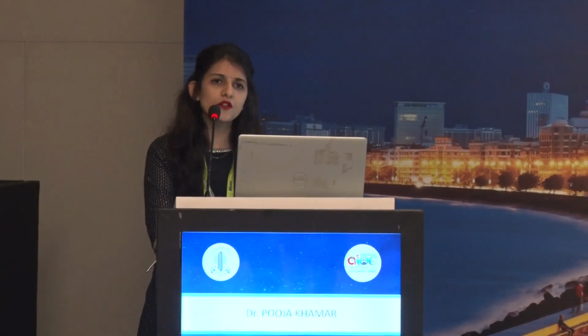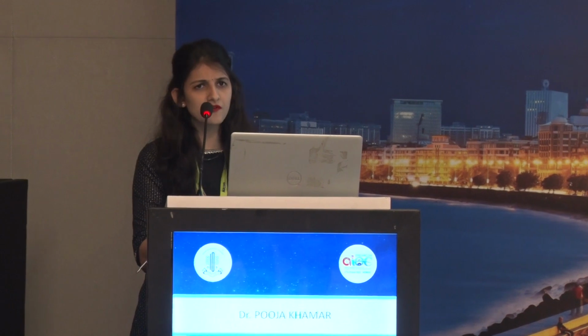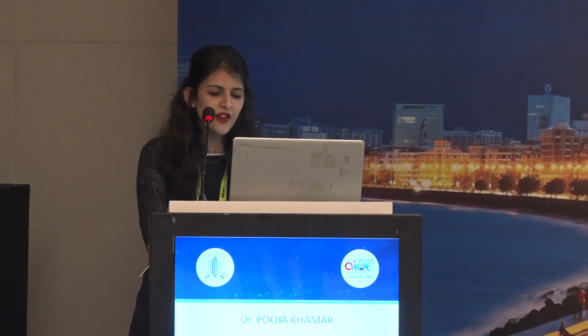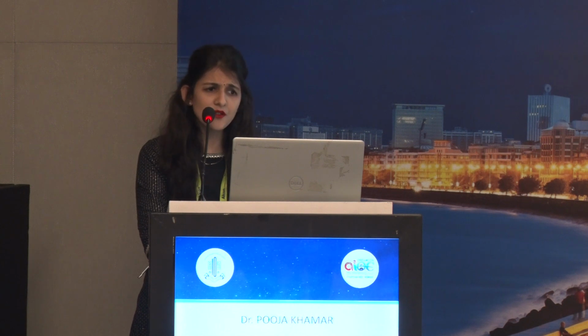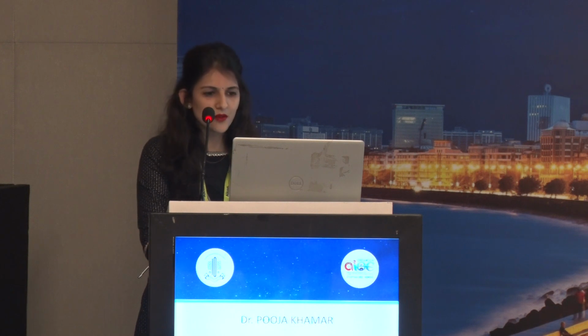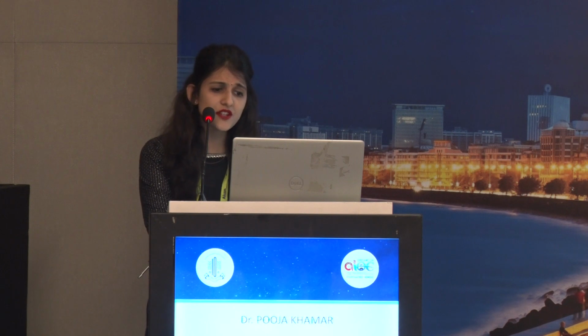that they do well. Now, of course, all these groups have used different kinds of keratometry readings. So some have based their calculation on the SIMK, some have used the TCRP. In our practice, in our institute, we rely more upon the EKR readings. So we discontinued the scleral lenses for her and we repeated the scans. The variability in the EKR was slightly better as compared to the previous, but now as you can see, I'll just quickly summarize. So as you can see, the EKR readings are almost 62 to 65.